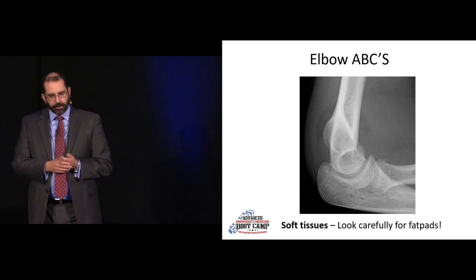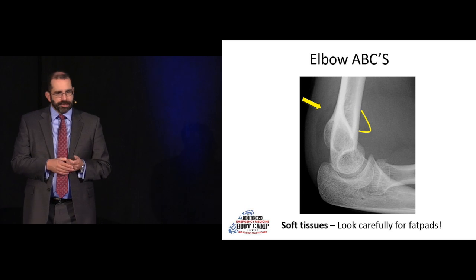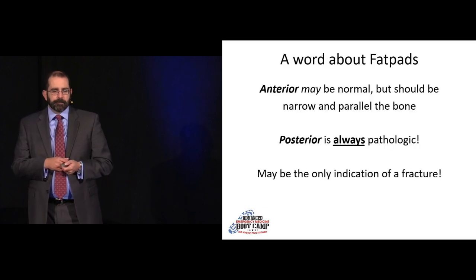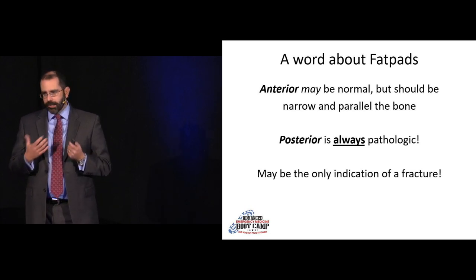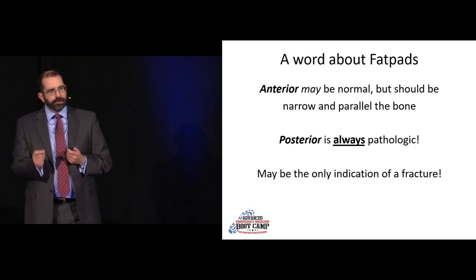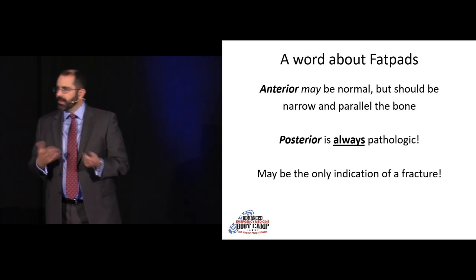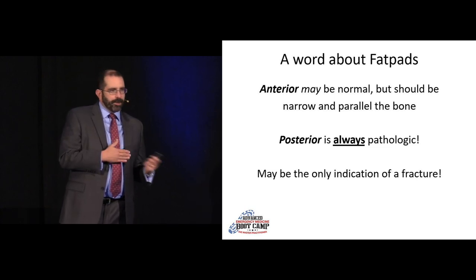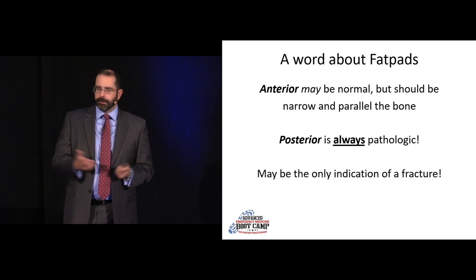Fat pads: there's a nice posterior fat pad and a big anterior sail sign — both are pathologic. Just like in kids, adults can have a normal anterior fat pad, but it should be very narrow and hug the bone. Once it splays out into that sail shape, it becomes pathologic. A posterior fat pad is always pathologic — P for posterior, P for pathologic — that's how I remember it.